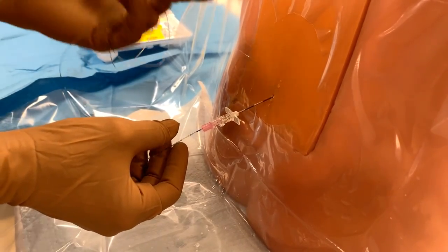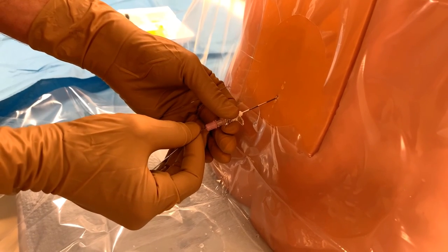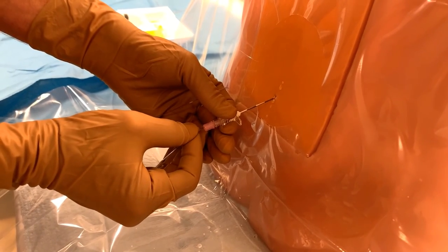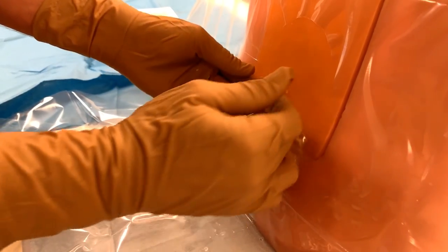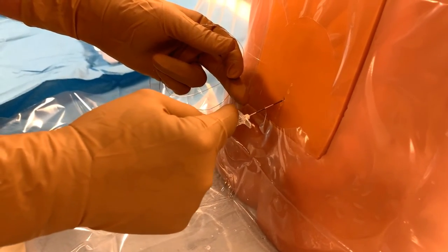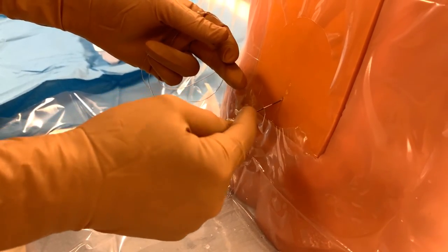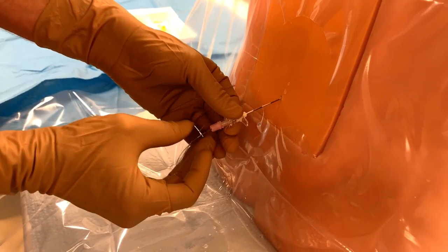Let's begin advancing the catheter. The entire needle is nine centimeters plus the hub, which adds another two approximately, so we're going to advance to about 16 or 17 centimeters.